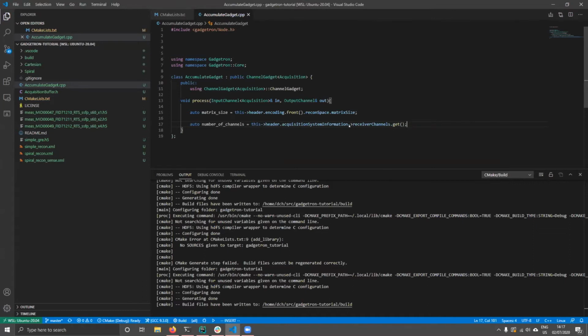Now, maybe you're wondering, maybe not, why do we use arrows here and dots up here? Well, acquisition system information is an optional field, so it might be missing. The same goes for receiver channels. Even if you have an acquisition system information, you might not have the receiver channels. But we're gonna go ahead and assume that they're there, the gadget will fail spectacularly if they're not. But for most data sets, that's a reasonable assumption.